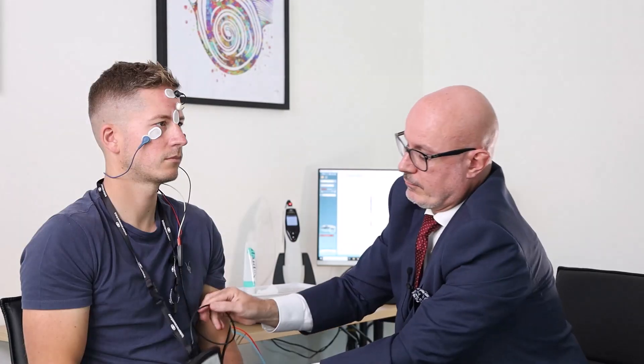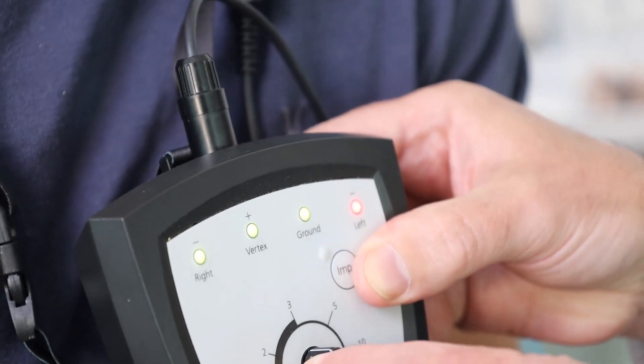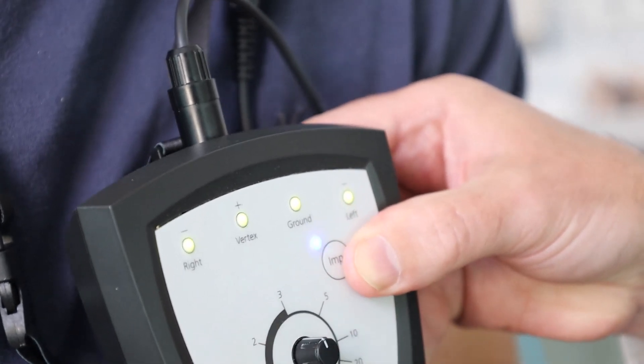And then we will check for our impedances. Those are nicely balanced at around four kilo ohms.